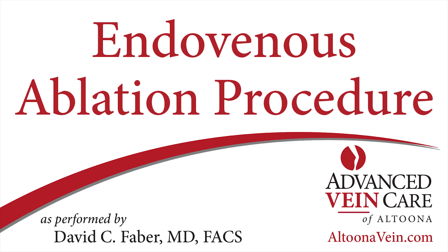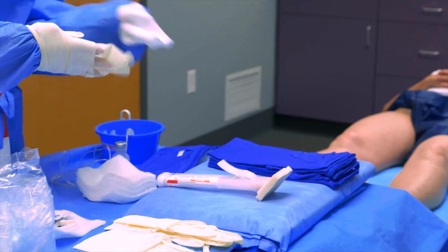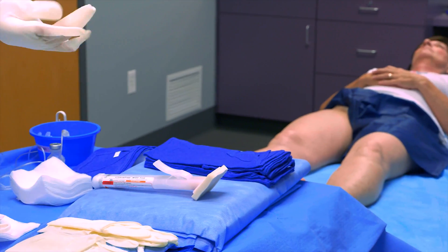This video will show and describe how varicose veins are treated with an endovenous ablation procedure here at Advanced Vein Care, performed by Dr. David Faber.